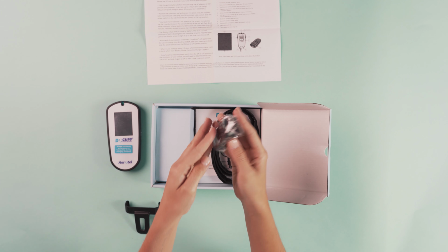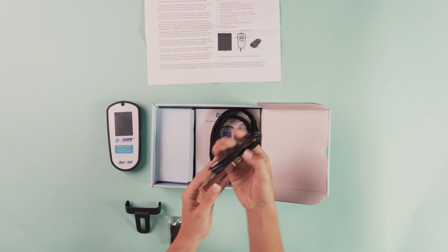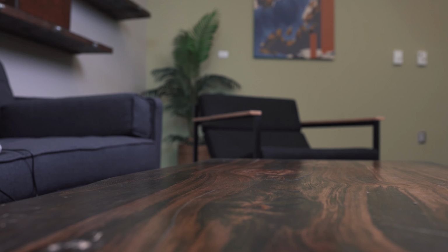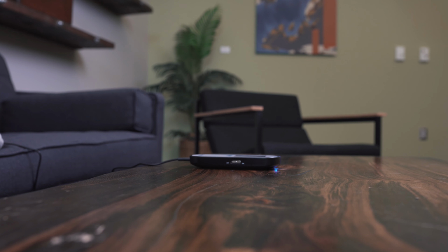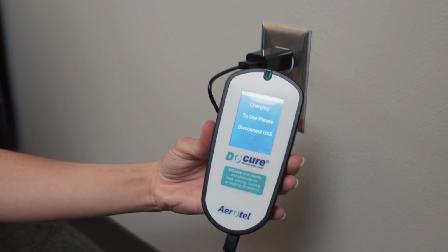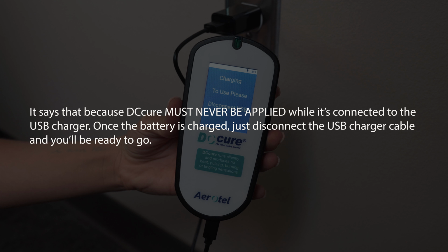Charging your DC Cure. Before its first use, fully charge DC Cure's battery using the supplied AC adapter or a USB port on your computer. It can take up to 2 hours to fully charge the battery, but DC Cure will quick charge in about 20 minutes for a single treatment. When you plug in the USB charger, the screen will light up, and you'll see "Charging, To Use, Please disconnect USB," after which the screen will go dark. It says that because DC Cure must never be applied while it's connected to the USB charger. Once the battery is charged, just disconnect the USB charger cable and you'll be ready to go.